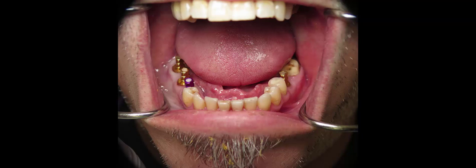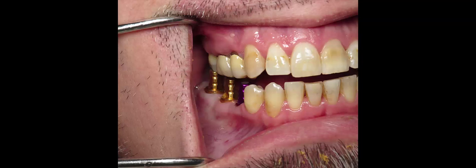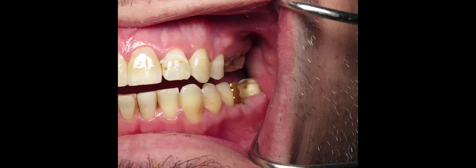A few months later, the impression copings are placed in order to take impressions. The gums have healed very well. The patient hasn't had any symptoms whatsoever. We're going to start some laboratory procedures.